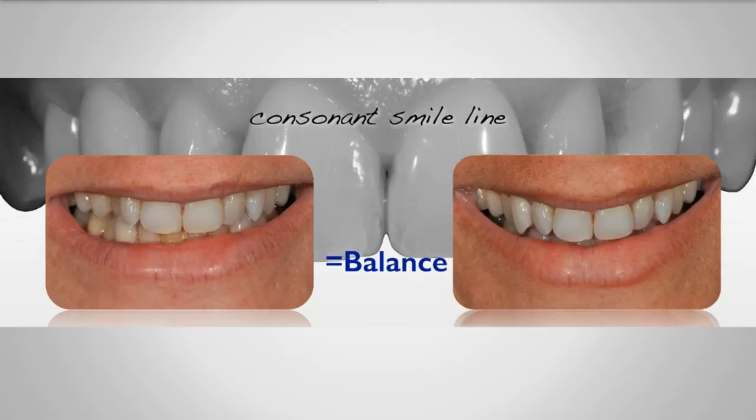I favor screw-retained temporary crowns and screw-retained permanent crowns. Why not? I'm not sure I answered the question. I do prefer screw-retained temps and screw-retained permanent crowns. Cemented crowns, again, the biggest issue with cementable crowns, there are two. One, not as predictable retrievability. Number two, you have a cement margin. Remember the 6 reasons that I told you. You can place a much deeper margin with your all ceramic screw-retained crowns. I just read a good review in the International Journal of Oral Maxillofacial Implants. No difference in the prognosis of the implants whether you use screw or cement retained. So that's more verification to use that technique.